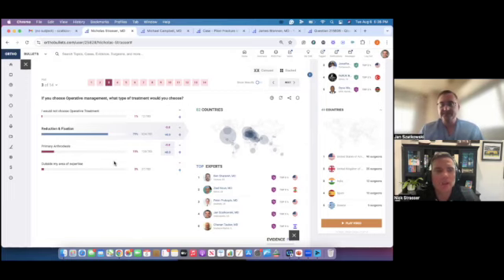Yep. And I should have said that as well: if you have a case that's highly comminuted, in a lot of those cases I'm not fusing it, even though that maybe seems a little counterintuitive. It is hard to get in there and adequately prep that joint and compress and have fixation across it when you have that much comminution. So in that situation, I'd do the same thing you would do. I'd most likely fix it.